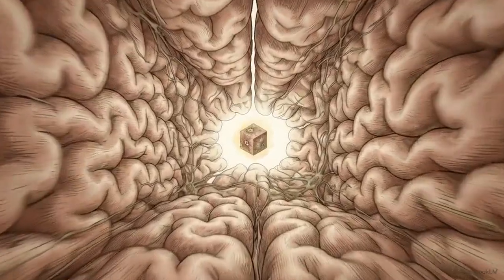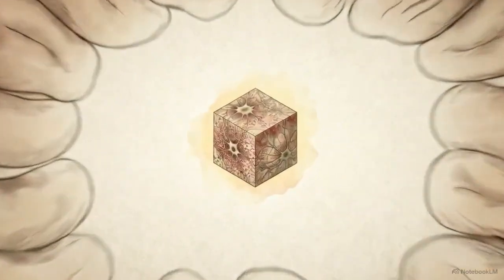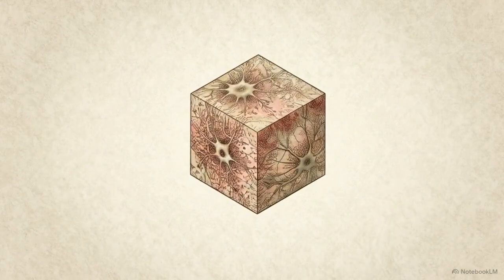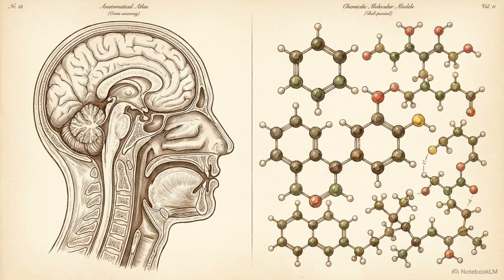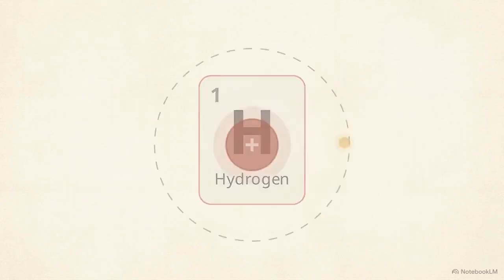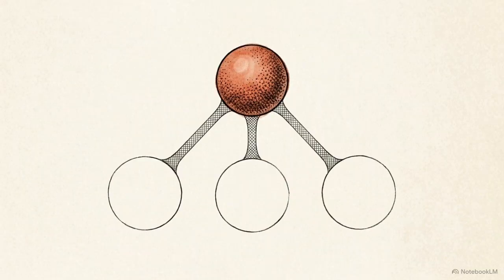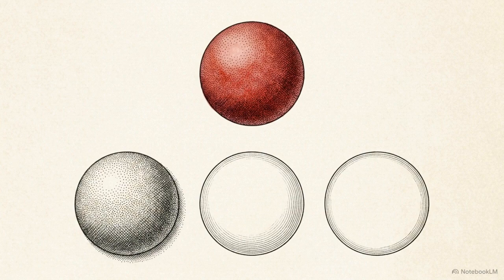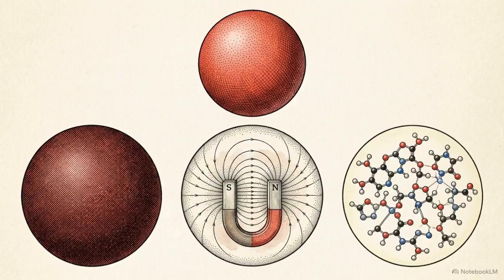To understand how MR spectroscopy works, we must look past the macrostructures of the brain, zooming down to an isolated, microscopic cube of tissue. Standard MRI uses the vast abundance of water to map spatial anatomy. MR spectroscopy isolates specific metabolites to map biochemistry. While we can target carbon-13 or phosphorus-31, we almost entirely rely on hydrogen-1, or protons. We target protons for three distinct reasons: 100% isotope availability, high magnetic sensitivity, and abundant presence inside target metabolites.